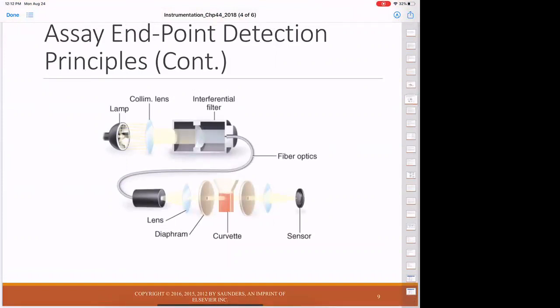Again, this is the image of the turbidometric or optical density methodology employed in coagulation. The photo-optical instruments detect the change in plasma optical density, light transmittance during clotting. Light at a specified wavelength passes through plasma, and its optical density is recorded by a photodetector. Formation of fibrin causes light to scatter, allowing less light to fall on the photodetector, thus generating an increase in the optical density. When the optical density rises to a predetermined variance from the baseline, the timer stops, which indicates clot formation.